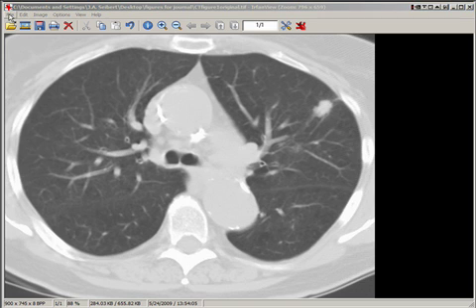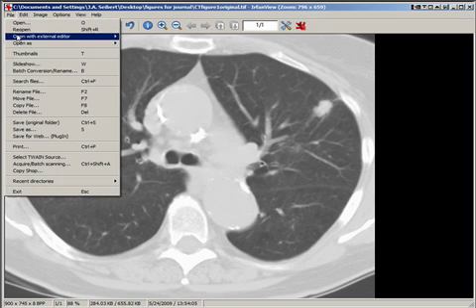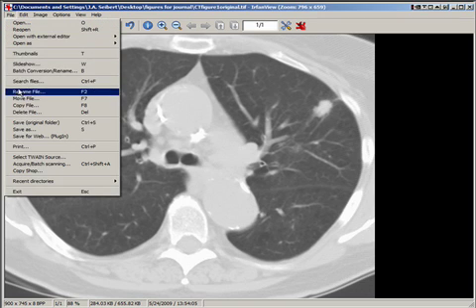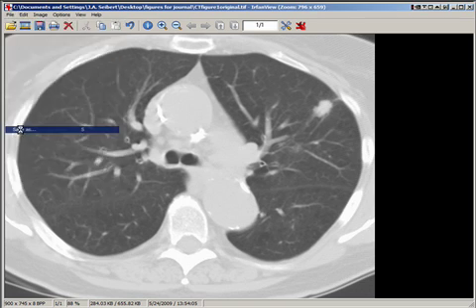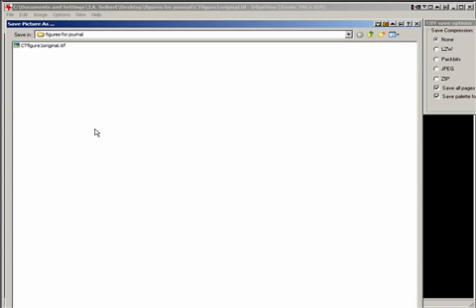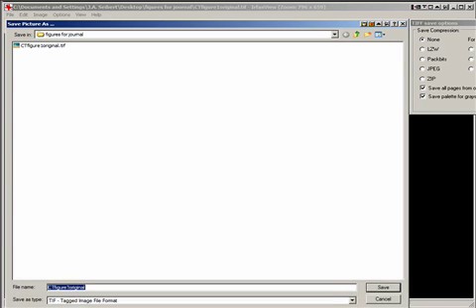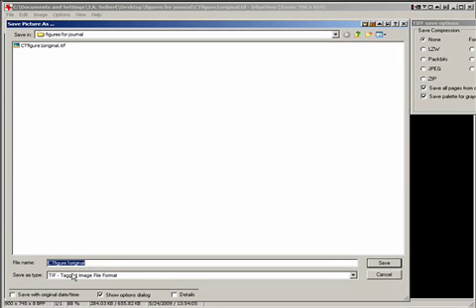Now we can save this image using Save As. Going back to the original folder, we can call this CT Figure 1 Final and save to disk.